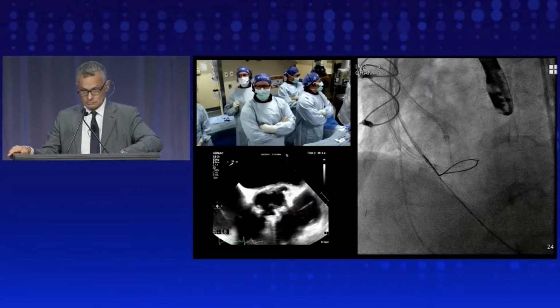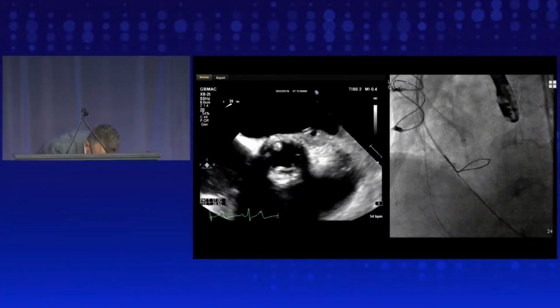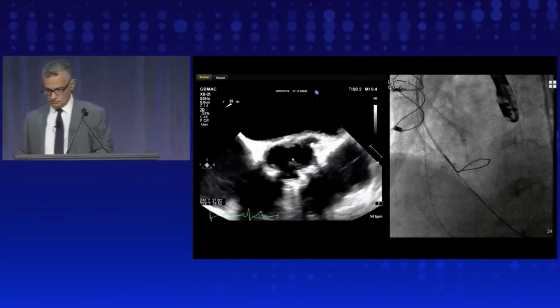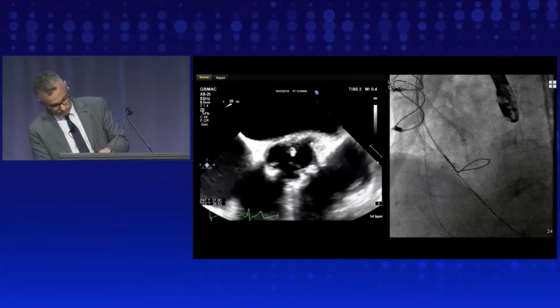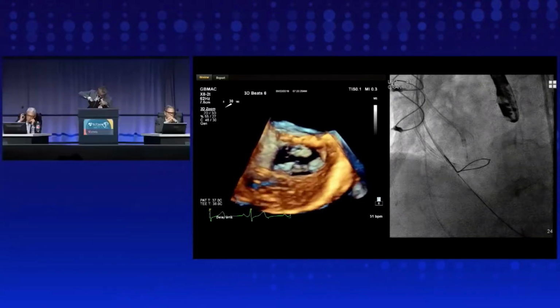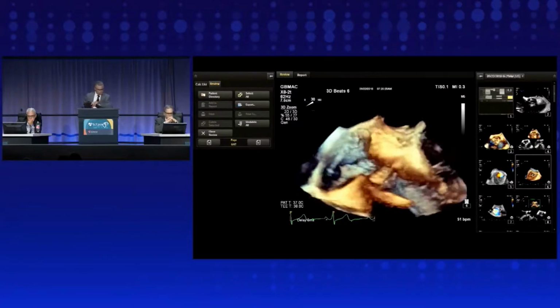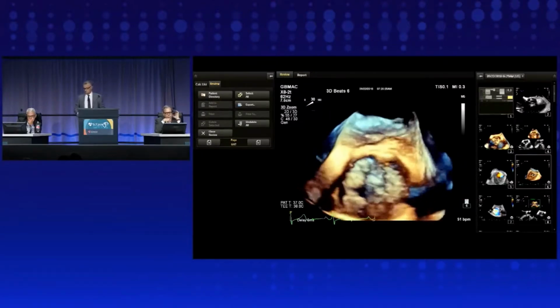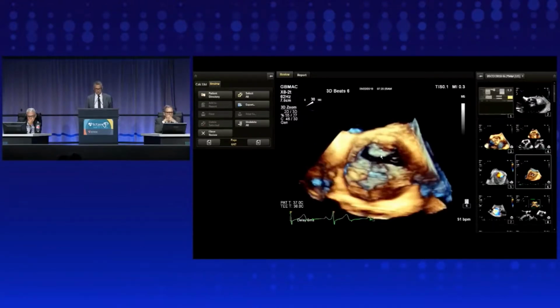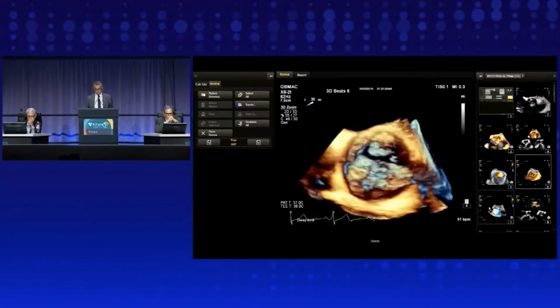Well, thank you. I'm starting with the short axis in 2D for this aortic valve, a Freestyle Medtronic, as we heard. If you note, the left coronary is nicely seen in this short axis, and you see a lot of movement of the leaflets. They appear to be thickened. Now I'm going to show you a 3D, which I'm going to turn around. This is the view from the left ventricular outflow tract. Turning it around, looking from the aortic side, you appreciate all the calcification on either side, as well as these thickened leaflets, some of which are prolapsing, which I'm going to show you in a moment.